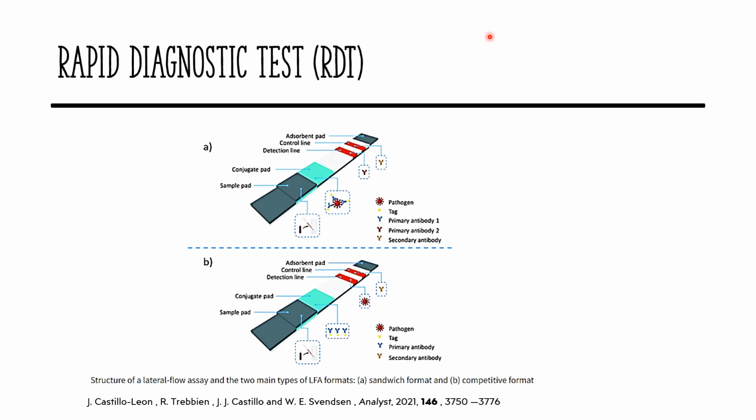Regardless of the quantity of analyte in the sample, an anti-species antibody at the control line will bind to the nanoparticle, yielding a solid control line signal, which demonstrates that the assay is functioning correctly. When testing lower molecular weight analytes with a single antigenic site, the competitive lateral flow assay is used.